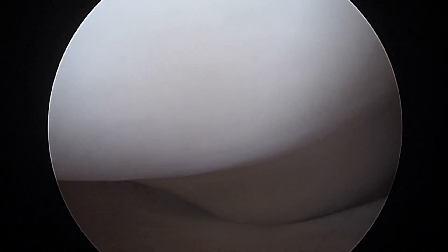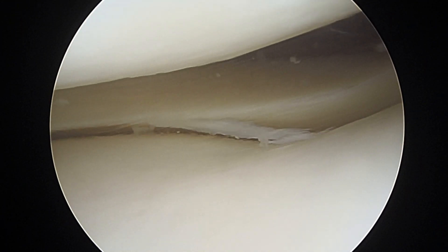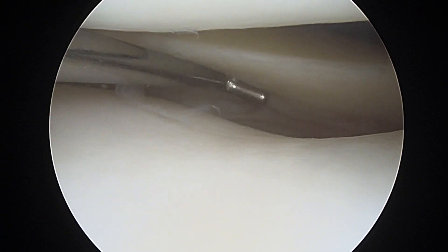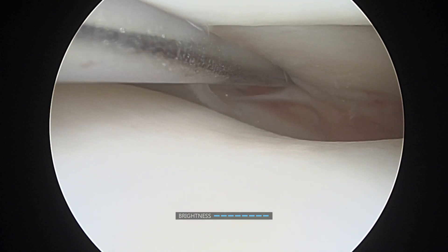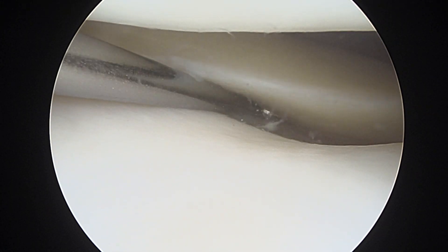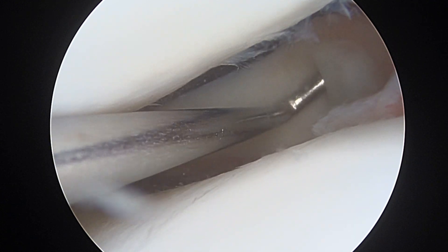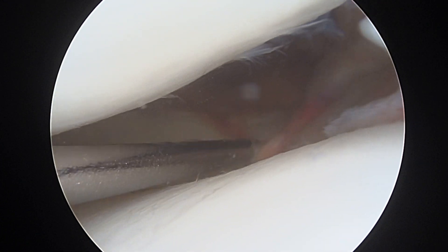Let's look at this lateral meniscus and see what we've got. A little inner rim. Slight tear. It's a little bit of nothing. Let's get a little better brightness back there. And that's the capsular border in the back. That's stable, though. And maybe a little bit of a posterior avulsion, but really not much there.